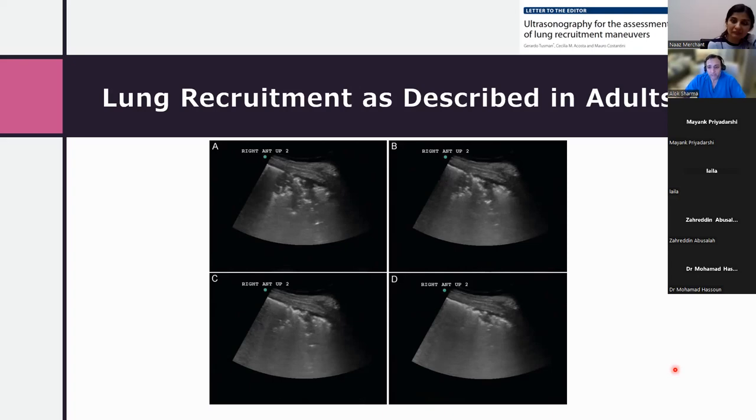But really, if I'm not getting improvement, I'm going to, within my limitations, basically go back to what I think is physiological, or if I find falls in blood pressure. And I would not hesitate to go back to a chest x-ray if I'm struggling. I want to see 9 posterior ribs.